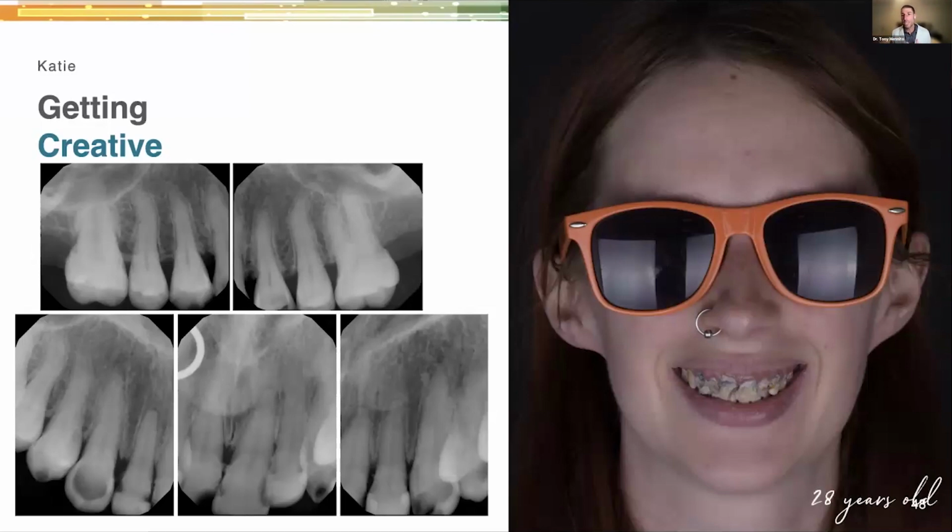So we're not really going to be able to rely on research studies, at least for a few more years, to help us predict how well these materials are going to hold up, because it takes so much time for that science to be generated and those research studies to be done. You don't want to be doing those research studies in your practice on a large scale on your patients, right? So I would say be selective about when you choose.